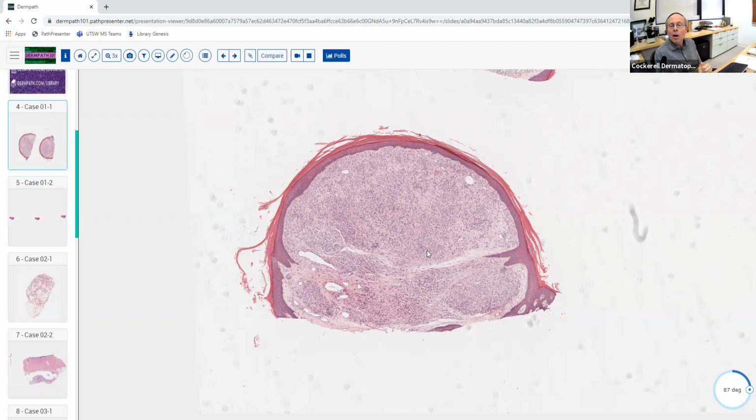I don't want you talking about the bone, for example, or somebody's heart when we're dealing with a skin biopsy. The same thing is true here. We don't need to talk about the epidermis. If you want to, you can say in 1 millisecond that the epidermis is not involved at all, so we're going to focus on the dermis where there's pathology. Then we ask ourselves whether it's an inflammatory or a neoplastic process. You can also ask what part of the body it's from and what type of technique it is, and those can be helpful.